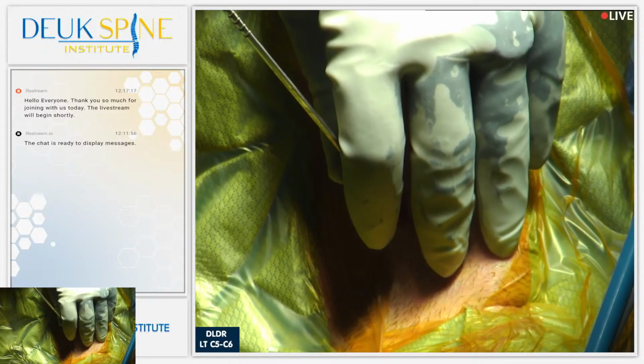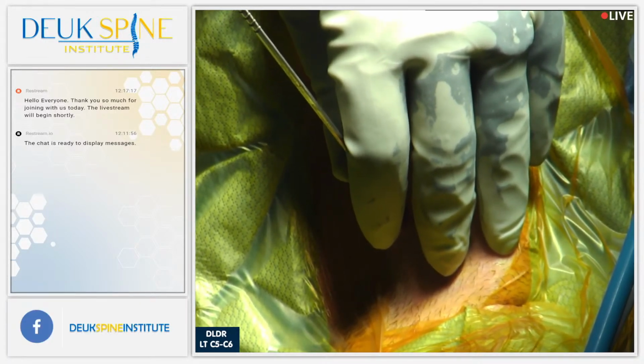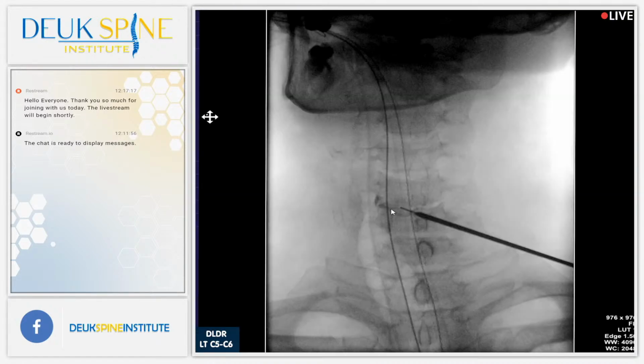Down a little. Okay, welcome back. You can see now how tears cause pain through inflammation. Look at the arrow on the screen here, Henry. That's a tear. It's off to the right side. Remember, his pain was off to the right. You don't see the same thing on the left. It's just the right. So he has a right-sided posterior tear at C5-C6.